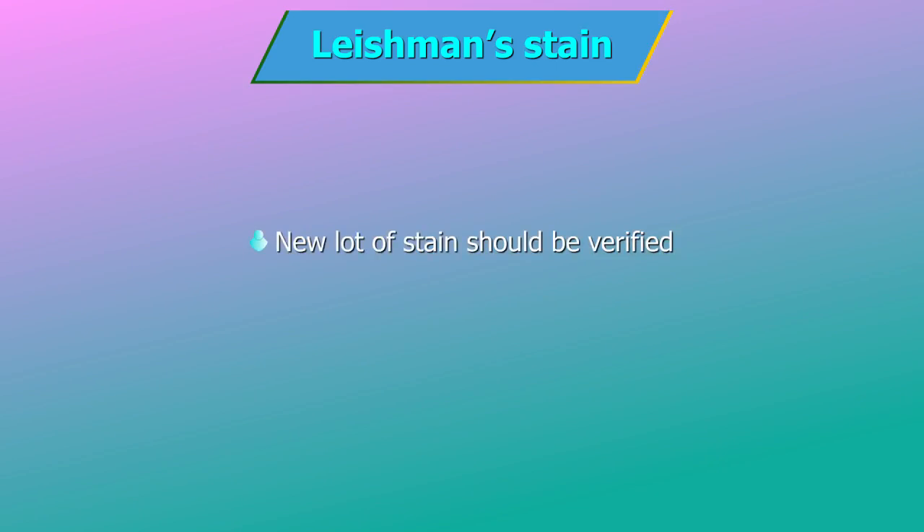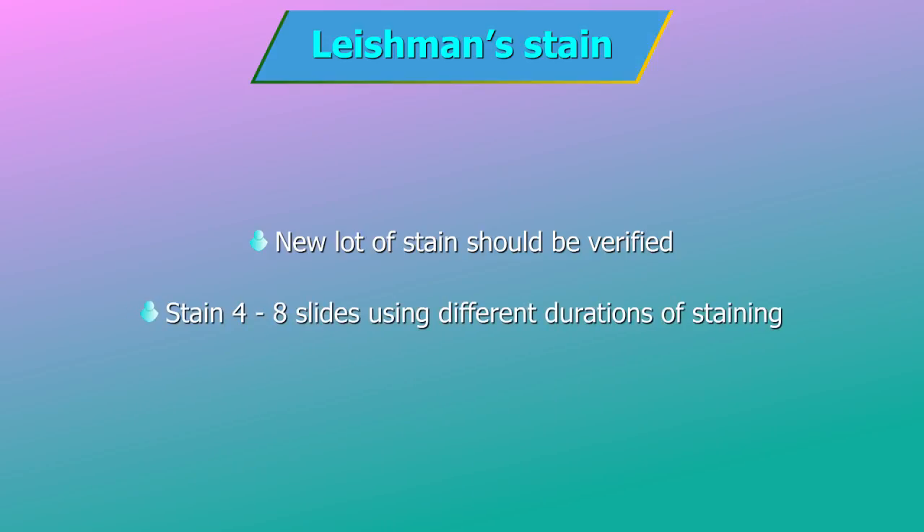Dry the slide and examine. Note: Whenever a new lot of stain is received, verify the new lot. Stain 4–8 slides using different durations of staining and check which slide is stained the best. Use the same duration of staining for that lot of stain.